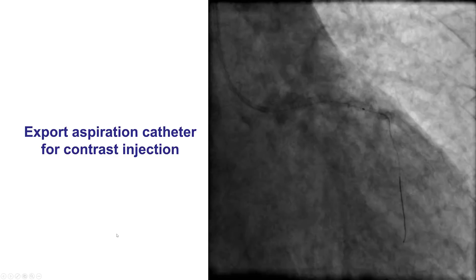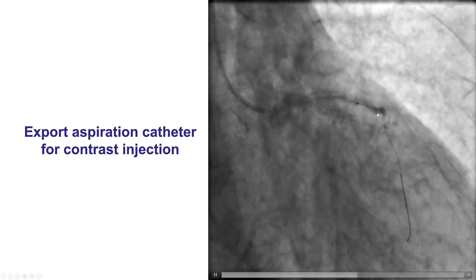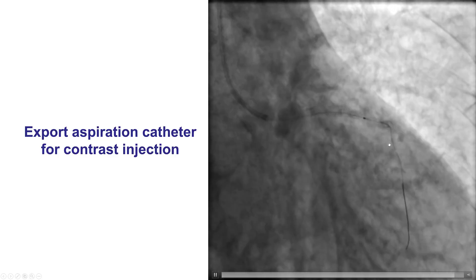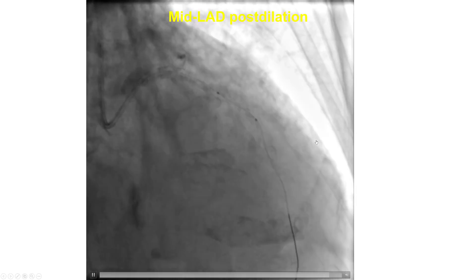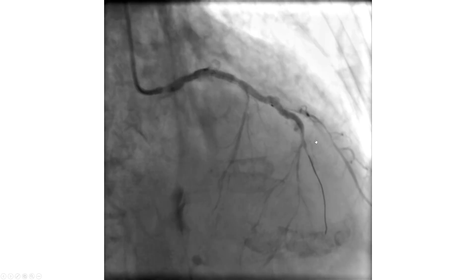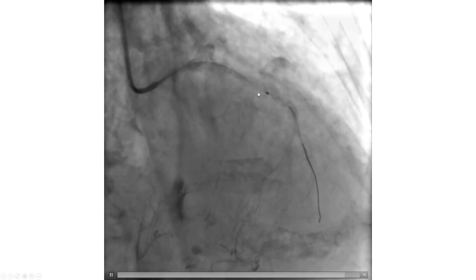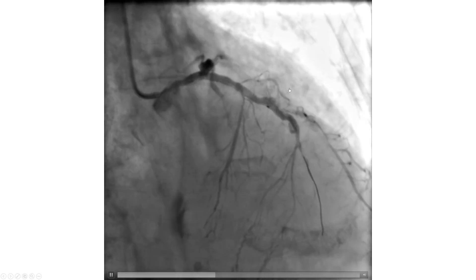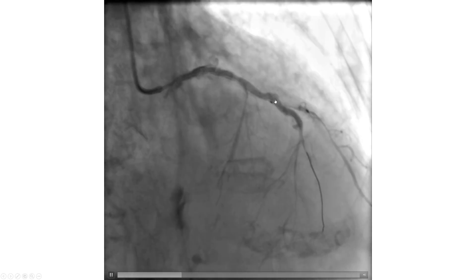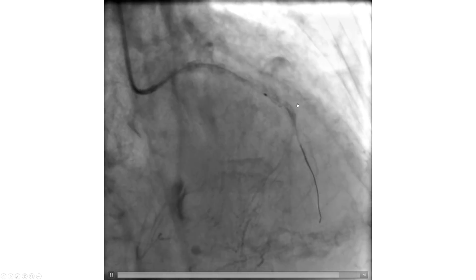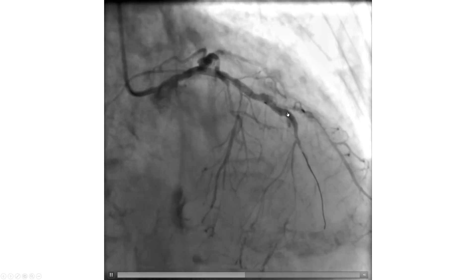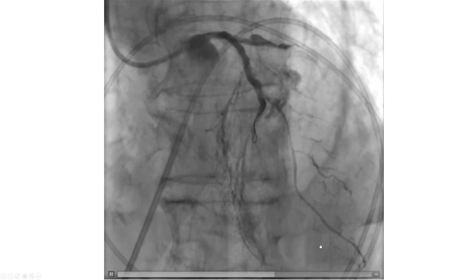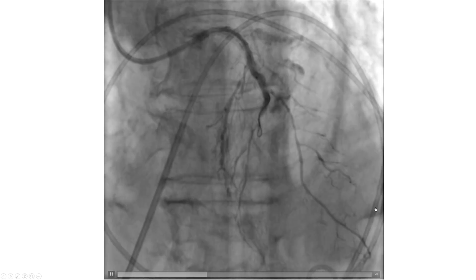That injection demonstrated some flow, but now there was something appearing in the LAD and the diagonal that was very worrisome for a perforation. We put a balloon up and on repeat injection we confirmed extravasation into the pericardium — so we did have a perforation. We initially thought this was due to the diagonal wiring attempts — a wire perforation in the diagonal. We placed a balloon, but the patient had continued extravasation and developed tamponade, requiring placement of a pericardial drain.